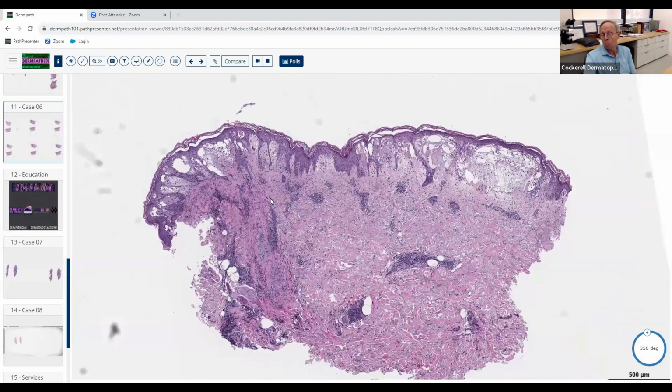So this one was dermatitis herpetiformis. But if you went down that differential diagnosis that you did of eosinophilic spongiosis and whatnot, like allergic contact dermatitis, bullous bug bite reaction, some of those kinds of things, that's certainly reasonable. So this is an example of a florid late stage DH, and this was confirmed with immunofluorescence. So I think it shows that sometimes DH can look a little bit different.